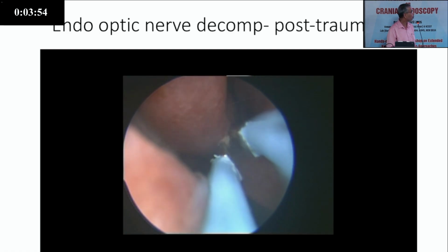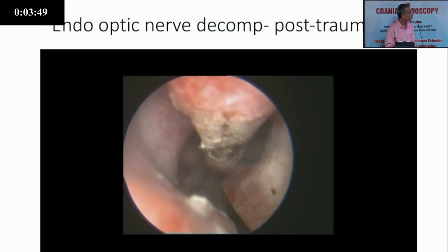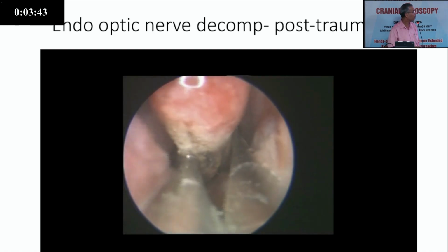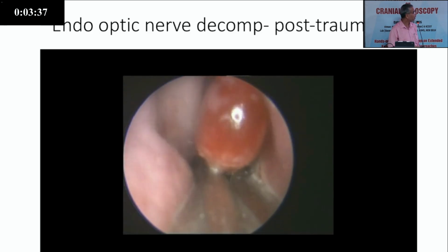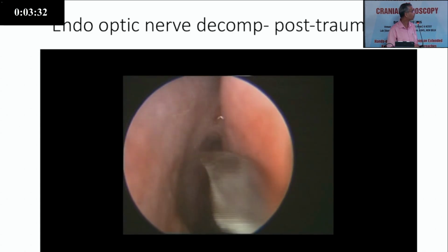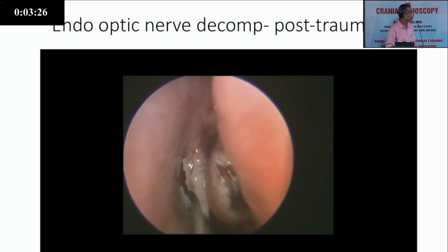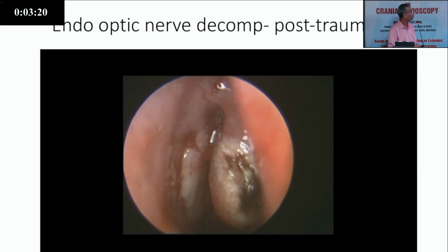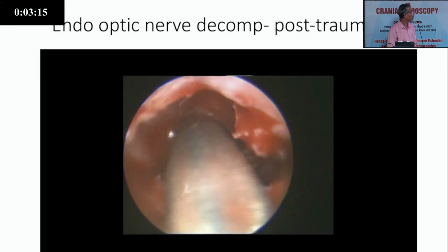So, taking bipolar cautery to cauterize part of the turbinate. Depending on how much space is there, you can excise it fish-mouth type, or you can leave it. In this, it was partly removed. The anterior end of the middle turbinate is better preserved, because that will be an important surgical landmark for subsequent surgery. So this is uncinectomy, with a sickle knife, incise it. You have to be careful there. Don't lateralize your knife too much, otherwise you will enter the lamina papyracea. This is bullectomy.